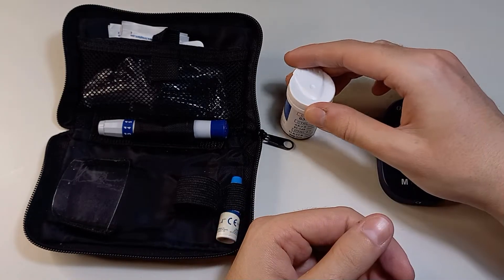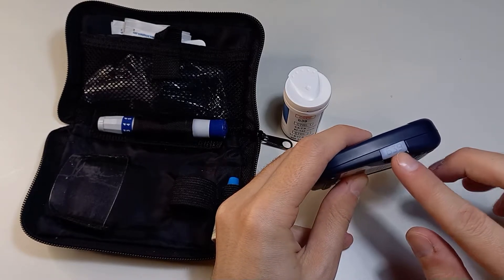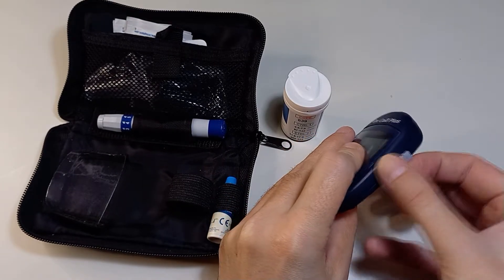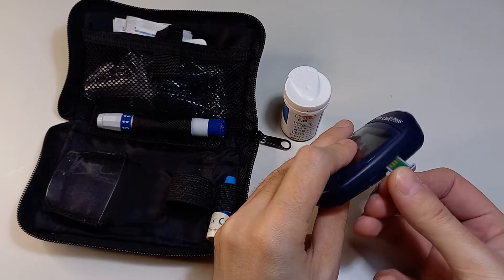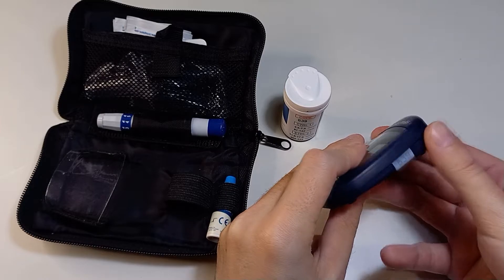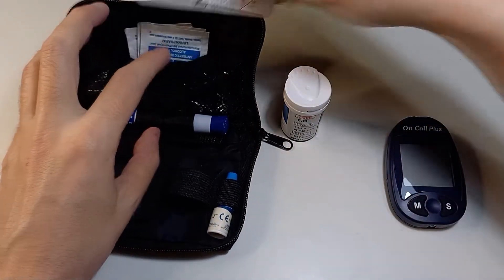With the strips there is also this chip, which has the same code as on the container. You have to insert it into the slot of the device. Now I have to insert the battery.